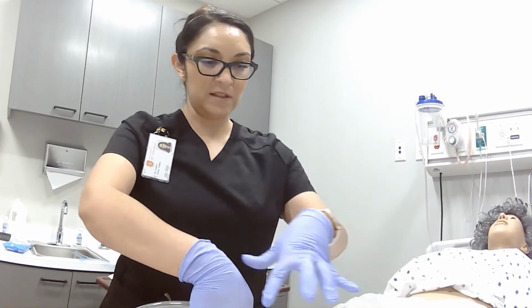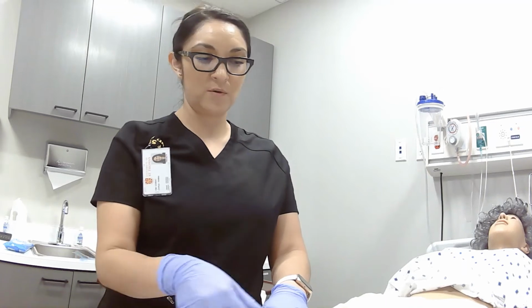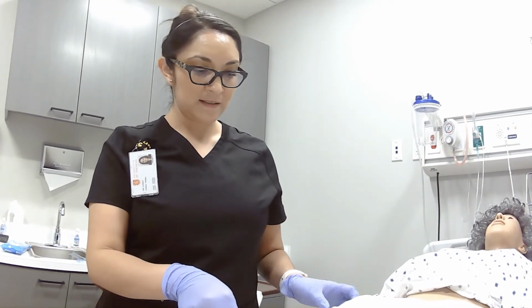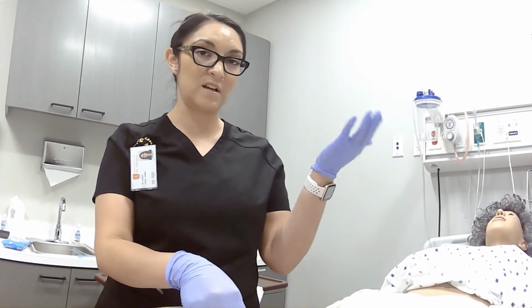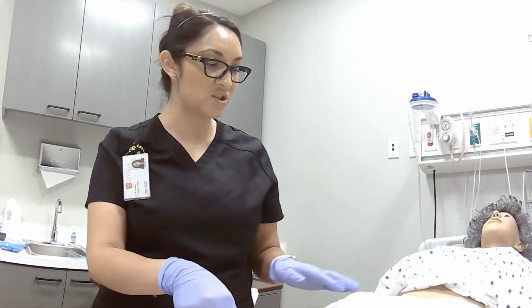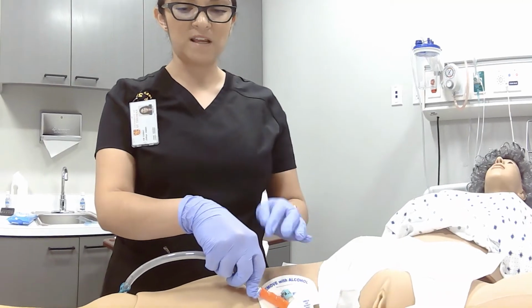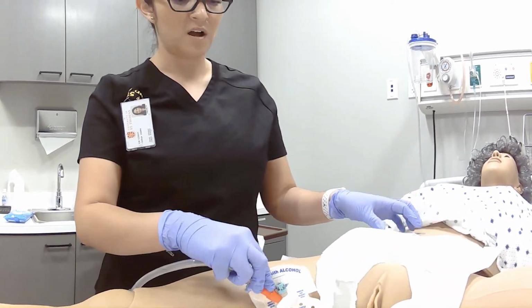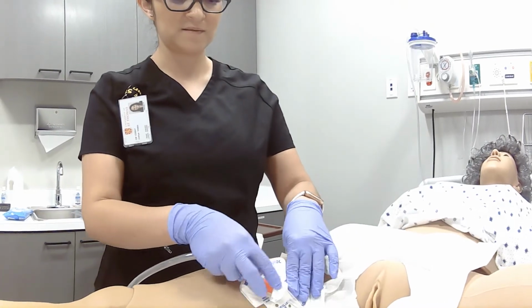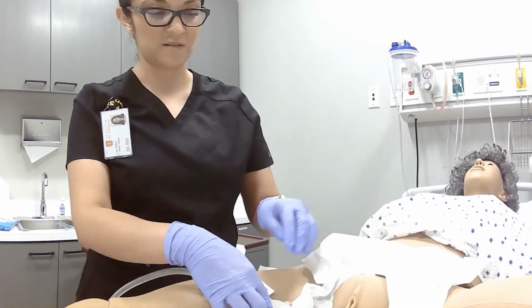And then we clean all of this up, throwing it away, and making sure that the patient's bed is in the lowest position, side rails up x2, call light within reach, and that we've taken care of all the things that we need to in the room while we're in there with the patient.